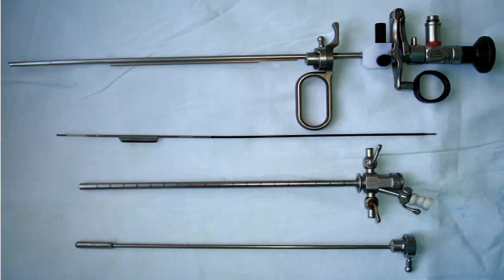So what is happening in bipolar? That is what sir was asking. Simple. Bipolar, sir, basically what happens is both are active, so that's why it generates that plasma arc. तो लूप में ही बाहर आ जाता है। लूप में से, yes. ठीक है, वो बॉडी से बाहर नहीं आएगा। But sir, ठीक है, बाकी अब, what is Iglesias system?